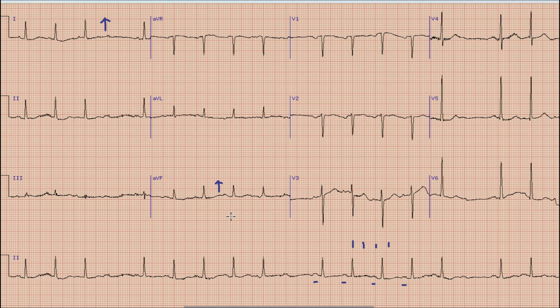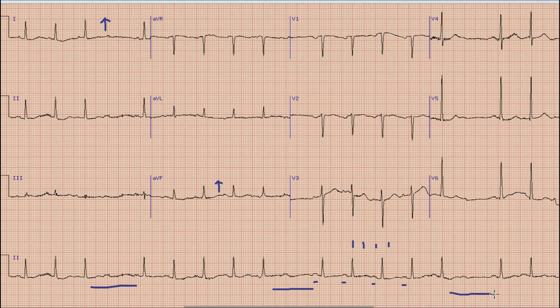Going forward, we can note that there are intermittent pauses between the QRS complexes — one here, another pause between two QRS complexes here, and another pause between these two QRS complexes. The next question is: what is the reason behind this irregularity in the rhythm, or these pauses in the rhythm?